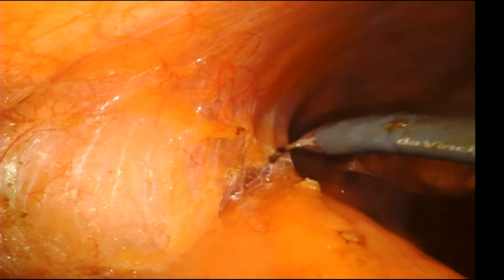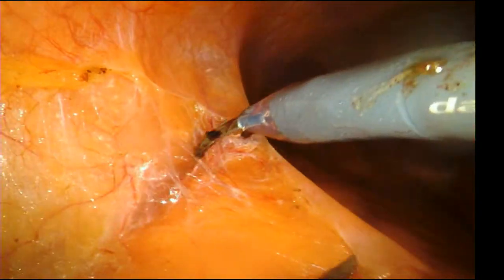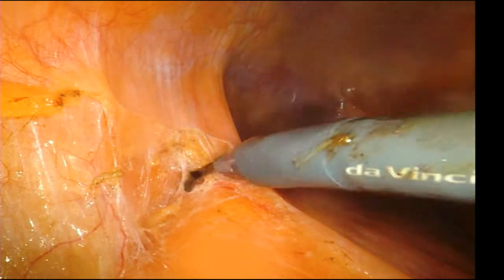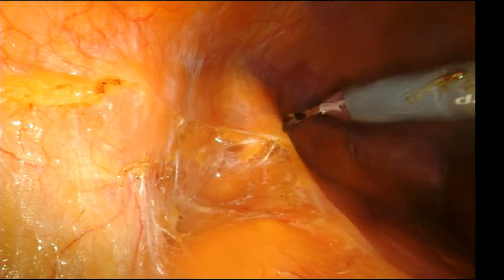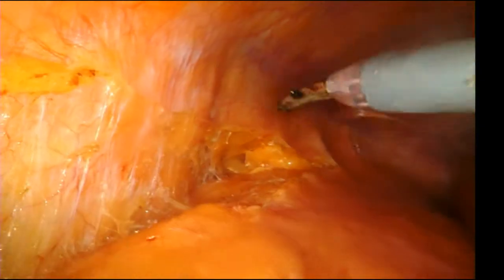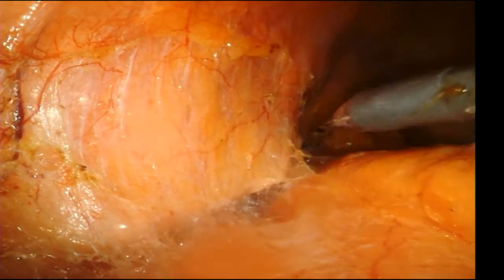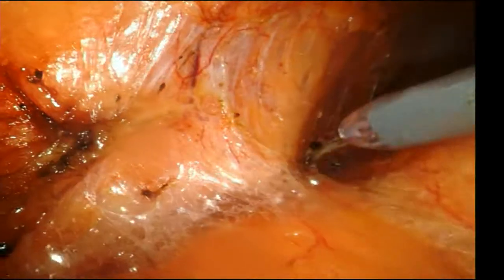I don't do all posterior tumors retroperitoneally, and I'll tell you why. I know some people, like, for example, Jim Porter, will say, I draw a line along the kidney. If it's posterior, I do it retro. If it's anterior, I do it trans. And they just go by that line. I'm a little bit more hesitant to do retro on some tumors, even if they're posterior. The time that I won't would be if a tumor is really lower pole.